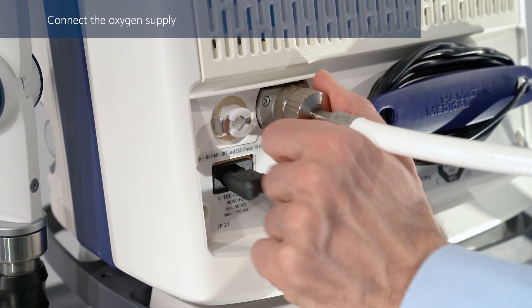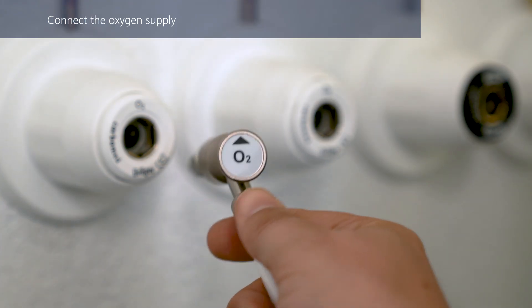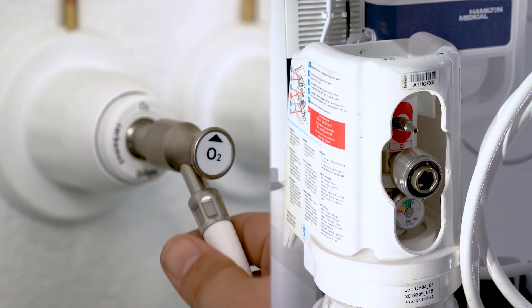If you haven't done so already, connect the oxygen hose to the ventilator, and then to the gas supply or a gas cylinder.